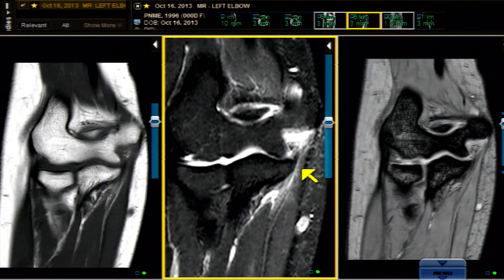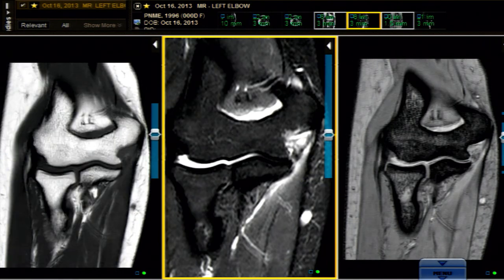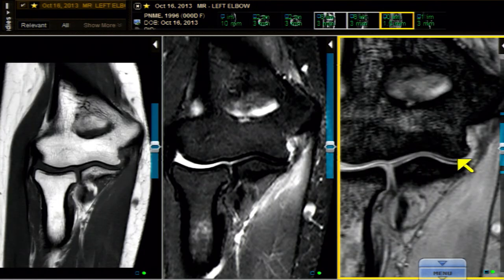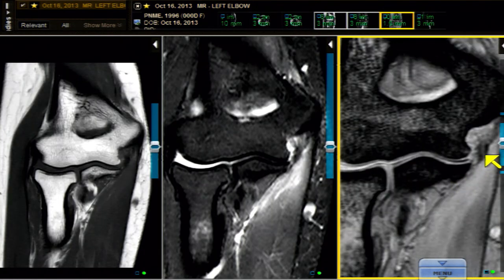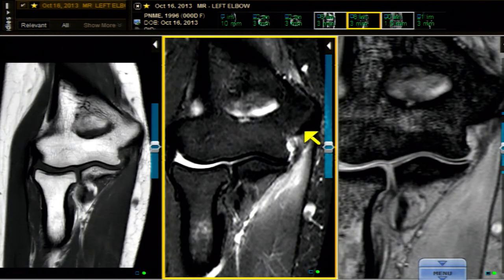That separation of the UCL — which should be snug as a bug in a rug on the sublime tubercle — is also torn. This is one very sick UCL. Sweeping through it, the gradient echo image is a little thinner but probably not as informative. You can see that the UCL is not tightly adherent to the ulna. This case is unusual because at certain loci the proximal end is off, and at other loci the distal end is separated — all focused on the anterior bundle of the UCL.